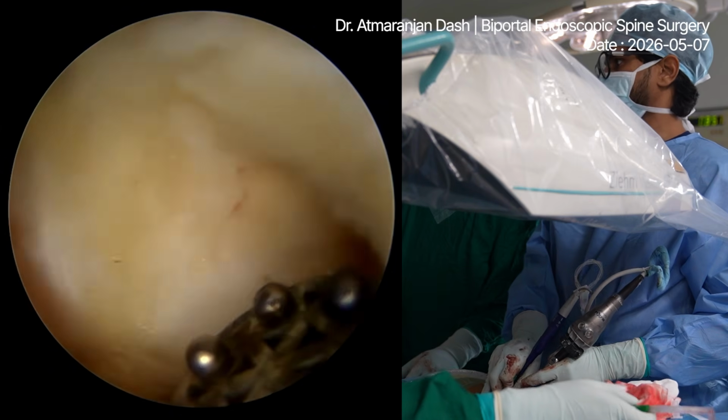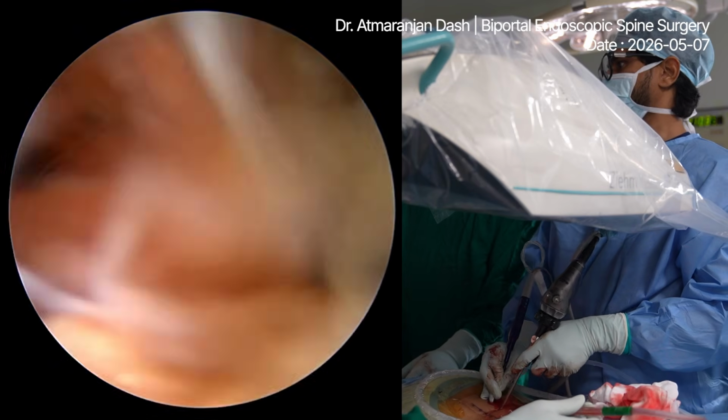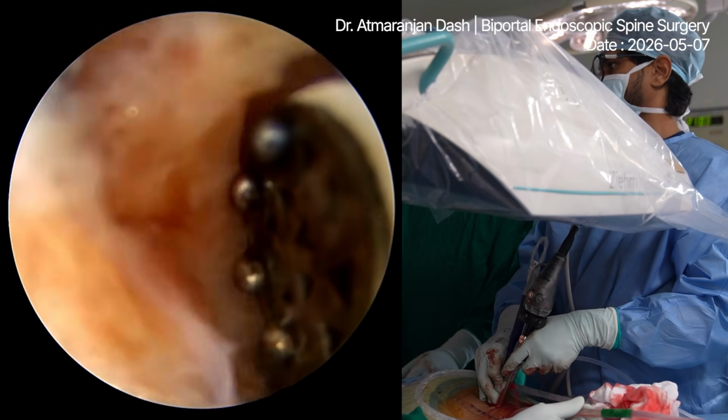The oozing sometimes can be cumbersome, but can be taken care of by generous ablation, coagulation.